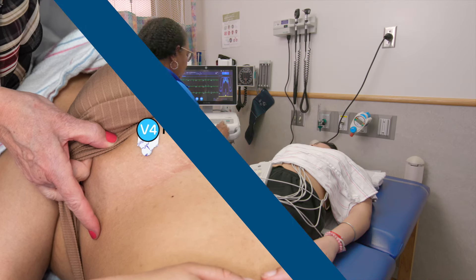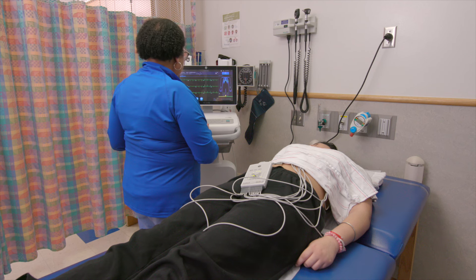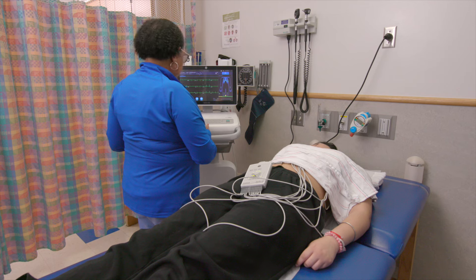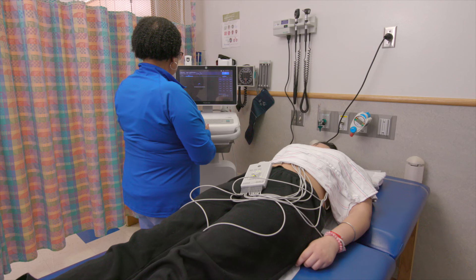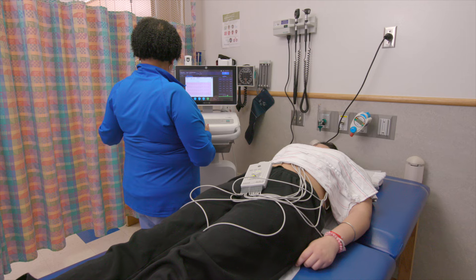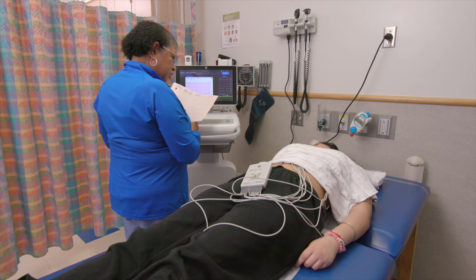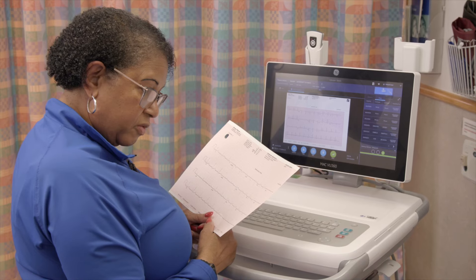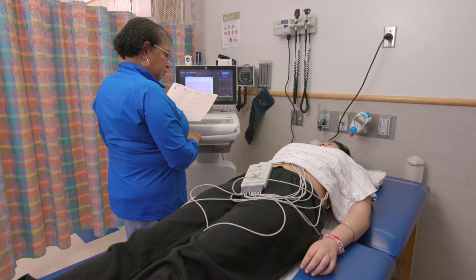Okay, all your leads are hooked up now. Now we're going to run your electrocardiogram. Once again, nothing hurts — you won't feel it. Okay, so your ECG is all completed. Now we're going to show it to your physician. You're all done, and I'll unhook your leads, all right?